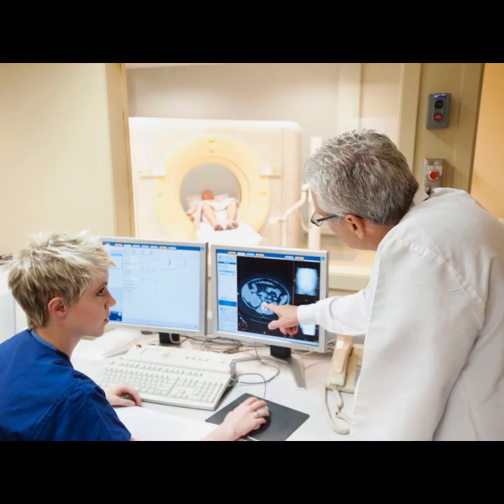I agree that physical refocusing is a powerful tool, but that elegance comes at a pretty severe cost: time. The spin echo sequence inherently demands a longer repetition time, the TR, and that drastically limits the overall scanning speed. Dynamic trajectory optimization, on the other hand, fights the tyranny of time in a more subtle, perhaps less costly way. Since the learned trajectory prioritizes speed, remember, the velocity of K-space traversal is proportional to the gradient strength, it ensures we spend minimal time acquiring that vital central K-space data, where the signal is strongest.